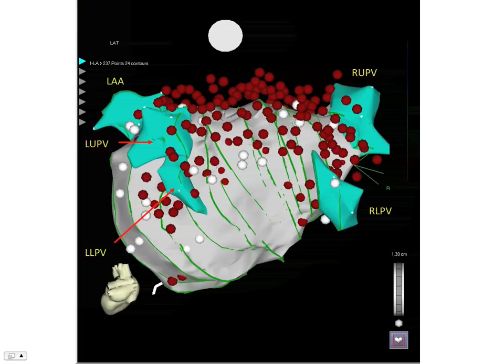In several patients with a history of atrial flutter, additional lesions were delivered across the cavo-tricuspid isthmus with the endpoint of bidirectional block across the isthmus. In seven patients, the SVC was isolated along its junction with the right atrium. At the end of the procedure, patients were either spontaneously in sinus rhythm or were converted into sinus rhythm, and all pulmonary veins and the SVC junction were remapped.